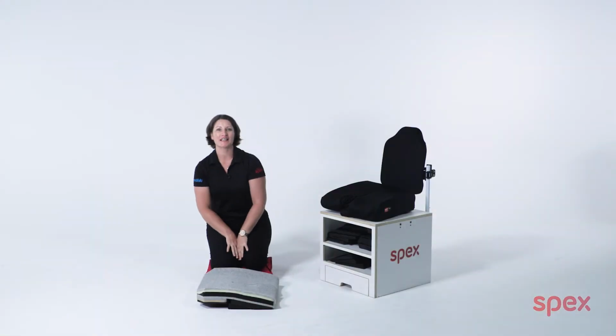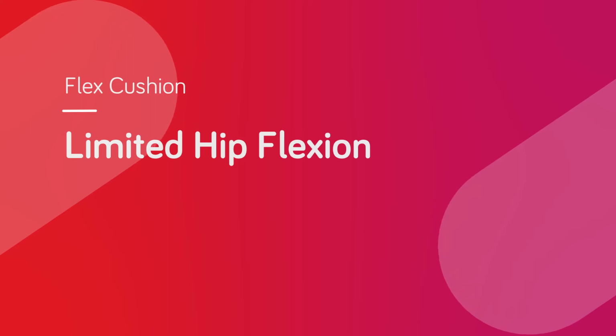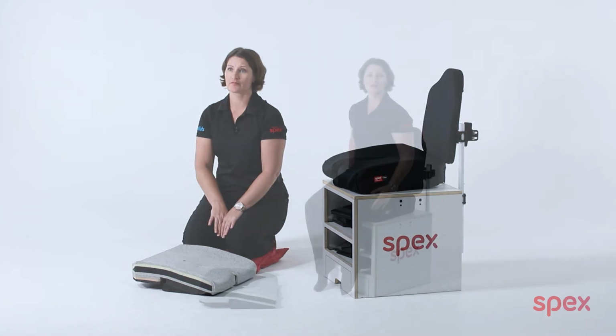Hello. In this video, I'm going to highlight how to adjust the flex cushion for hip flexion limitations. Hip flexion limitations mean the knee cannot be raised to the level of the hip. This can be due to muscle tone, muscle contractures, pain, or joint restrictions.